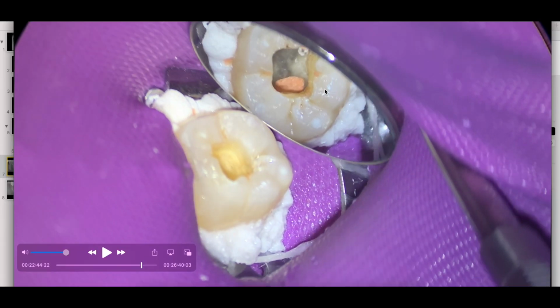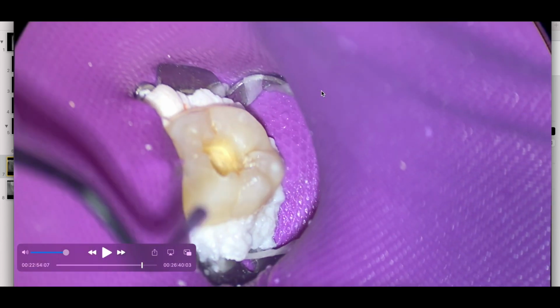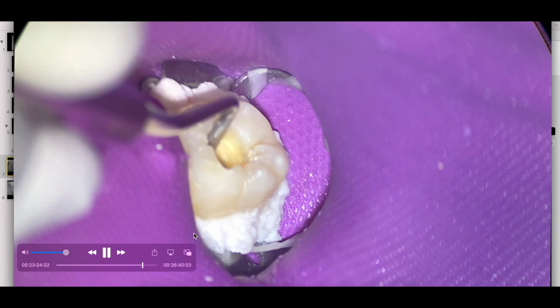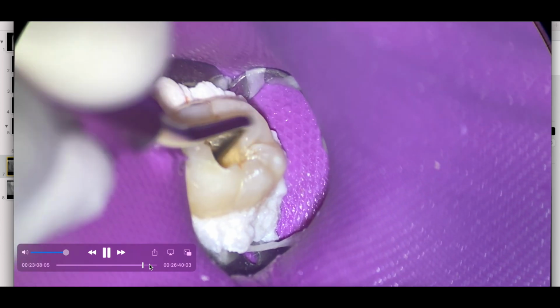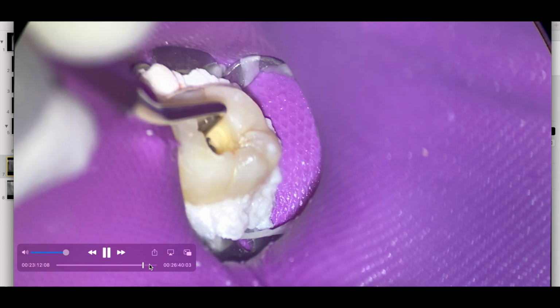All right, so here we are now. Placed our gutta percha, and you've got a nice wide fill there. And now what we're going to do is place an amalgam core restoration here. Now I know what's going to happen in the comments, and I was thinking about that as I was placing this. I'm going to refer this back for a zirconia crown for one of our other dentists.